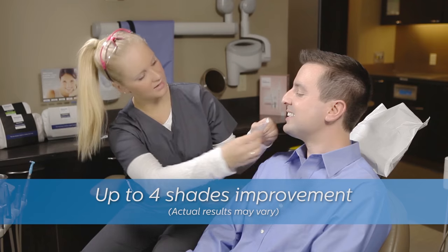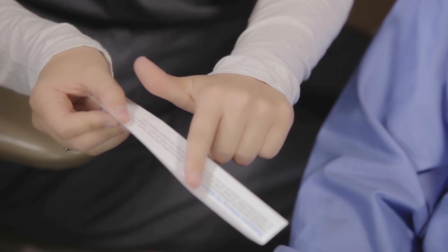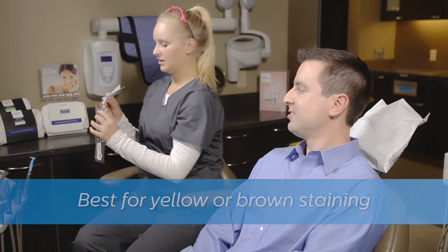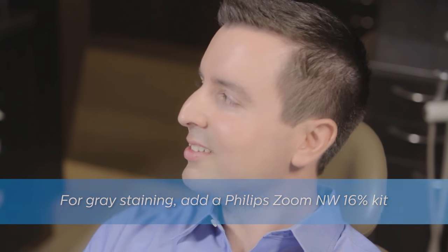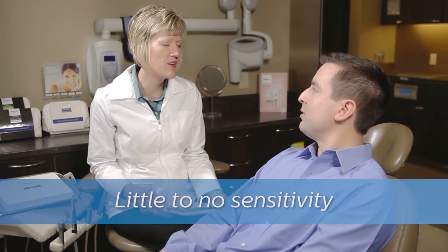Quick Pro is clinically proven to whiten up to four shades with just a single 10-minute chair-side application. Quick Pro is recommended for patients with yellow or brown staining who are most likely to see noticeable same-day results. For patients with gray or tetracycline staining, Philips Zoom recommends using our take-home Day White or Night White treatment with a Quick Pro session to achieve faster results. Because of its innovative sealer technology, most patients experience virtually no sensitivity with Quick Pro, making it an ideal choice for a wide range of people who might otherwise not be candidates for whitening.